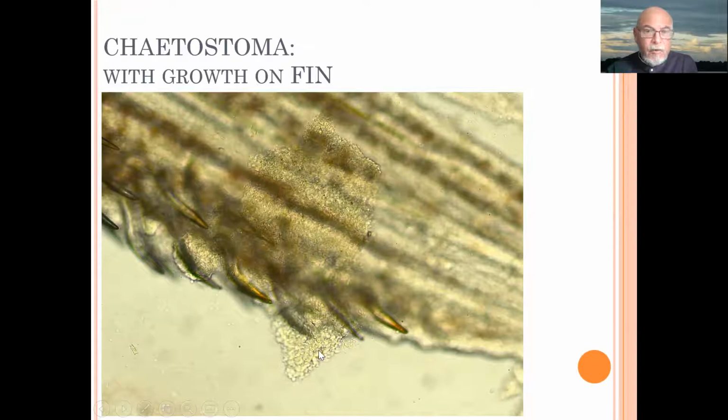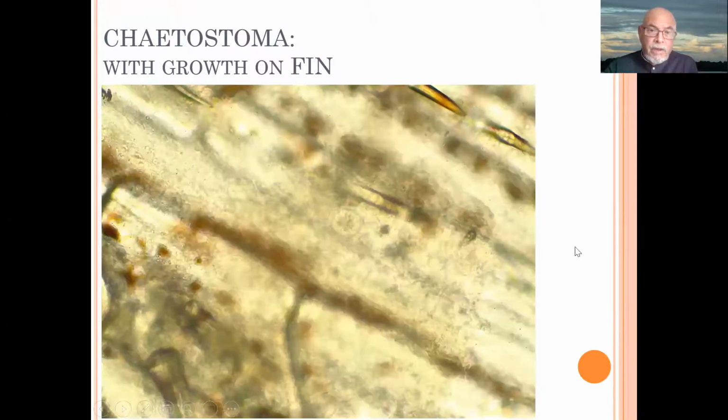That's the extra growth, which is like cells which are infiltrated with a virus, which are multiplying and causing this. Here you can see the inclusions in the tissue, sometimes a defense system. Here we can see some inclusions, and in most cases, in our experience, they are caused by a virus. We found some studies on that. But I tell you, in aquaculture, viral examinations are not well funded, not well researched. So it's a suspicion that it's a virus here also.